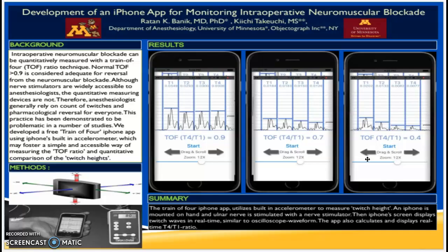After that, I submitted this app development story in an ASA meeting, and after that I forgot about the whole thing because I have other priorities in life, and this is not one of them. But when I joined this department, I showed this app to Mike Todd. I told him, Mike, I have an app which can measure train of 4 ratio.